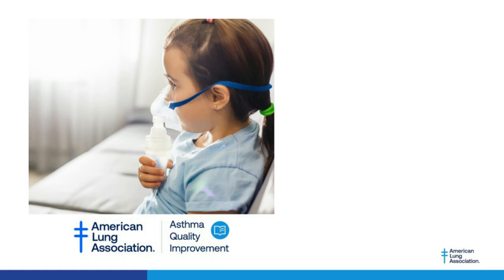Now, as you all know, the clinical dose is 2 puffs. But the American Thoracic Society did a bunch of studies suggesting that patients that aren't used to using MDIs many times don't get an effective dose. And so they suggested we always give 4 puffs when we're doing diagnostic testing. Great question. Thank you.